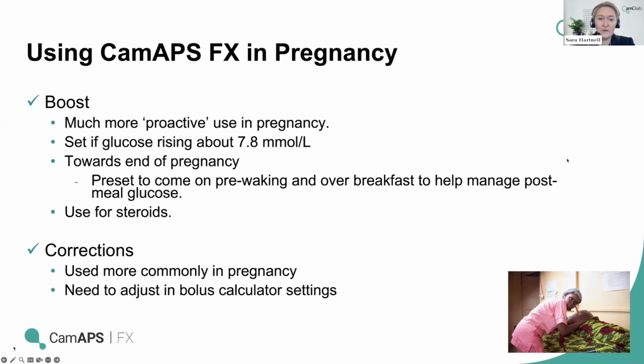So if someone's got boost programmed for say 2 hours, 4 hours, but the system predicts that the glucose level is going to be at target within a certain period of time, it will stop boosting. It will even take insulin delivery down to 0 if it thinks it needs to when boost is on, and then if it creeps back up again, it will start boosting again. So it's a super safe way to manage, and it really helped women, especially in that third trimester when insulin resistance is really marked, in keeping below that 7.8 millimole mark.